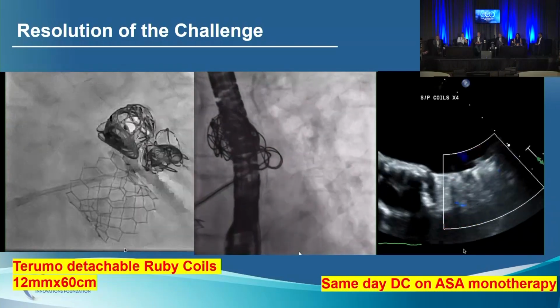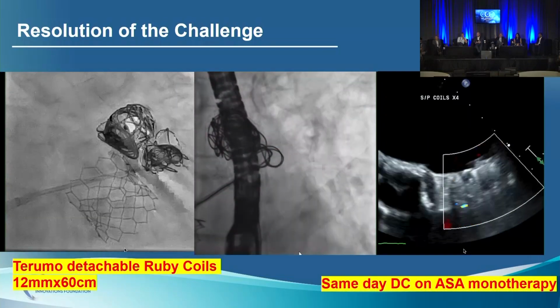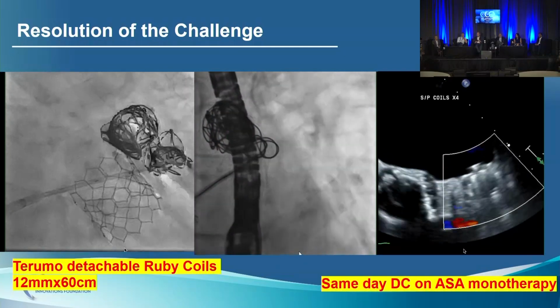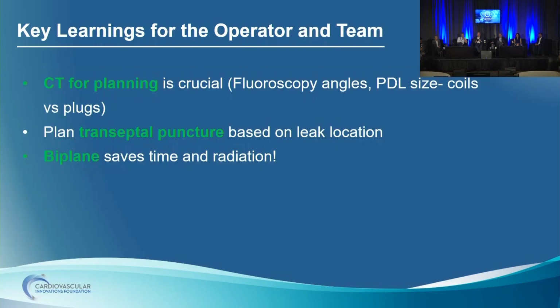I was also thinking of this hybrid, put an ADO or something in the front, but we didn't need to. And we were quite happy with our results. We sent him home on the same day with aspirin monotherapy.